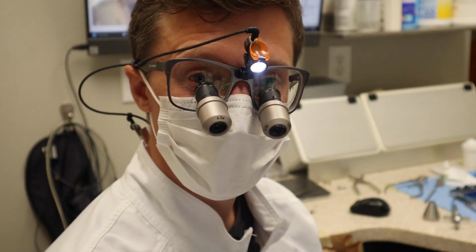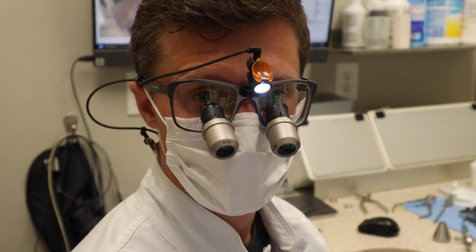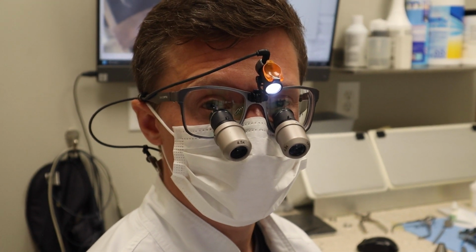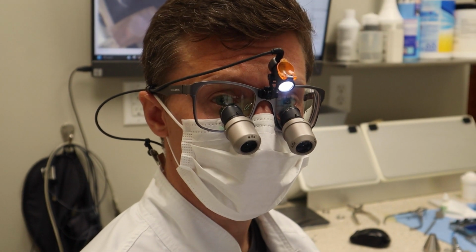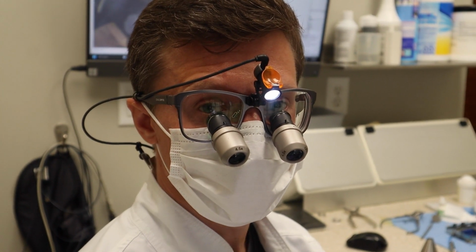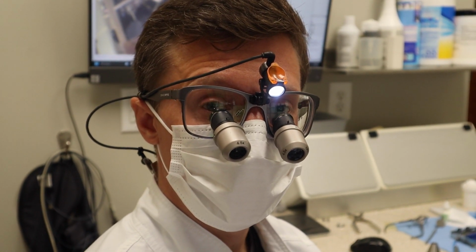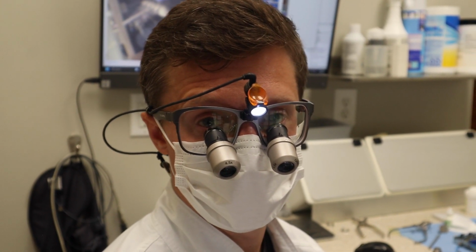So now that we have removed all of the decay and we feel like this is done in terms of preparation and decay removal, we found a couple things in this tooth. Number one, the cavity was pretty deep on one part of it and it kind of got close to the nerve. And the patient also told me that, hey doc, I had some sensitivity. So it wasn't really pain, it was sensitivity in that area. And what we're gonna do is apply some medication before we put the filling in. And this is done to preserve the nerve.